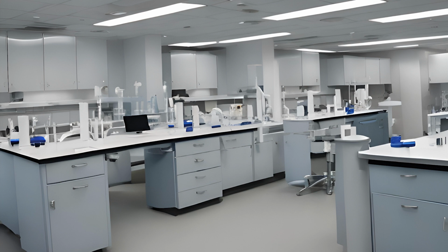Let your patient know that you're about to start the blood collection. Some people will want you to do a countdown, 1, 2, 3. Some people may not want you to do a countdown. In my personal experience, I found that I have less satisfied patients when I do a countdown prior to drawing their blood, because I am mentally priming them to think that they are about to experience pain on a set interval, and then their expectations are fulfilled and they experience pain when they get their blood drawn as the time hits 3.